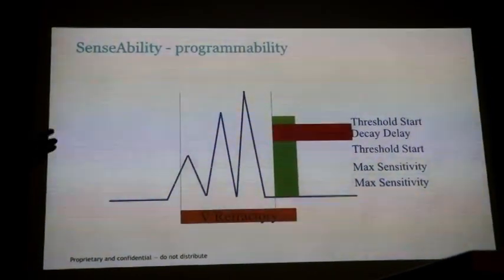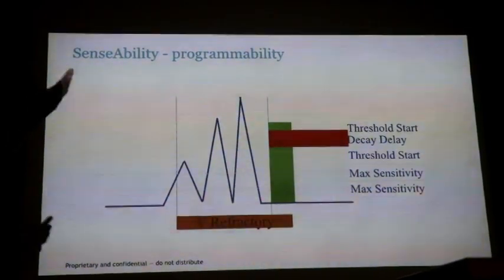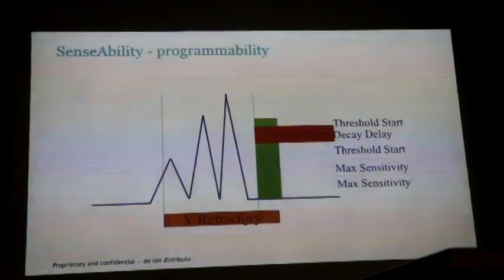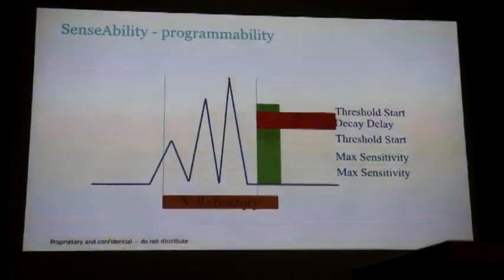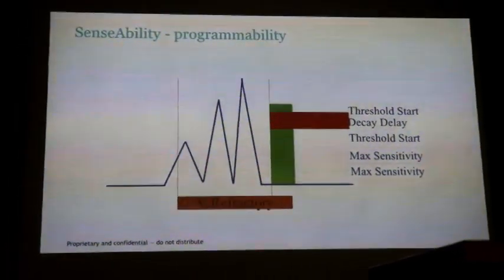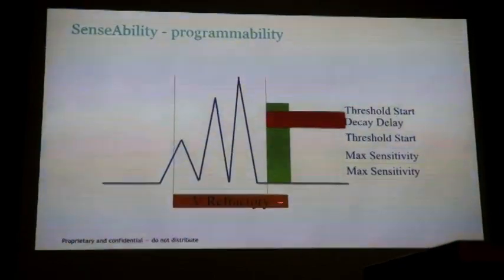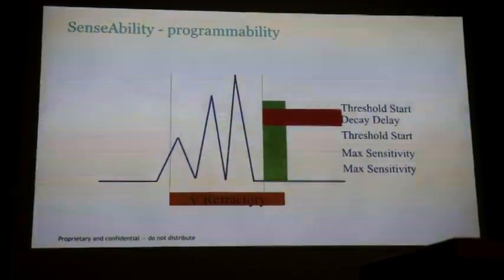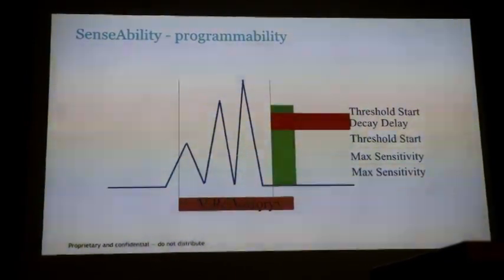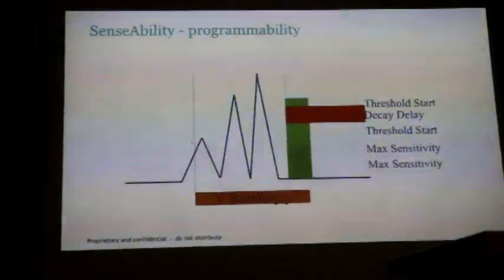So there's all this technology, and it's kind of like, well, which one do I use for which situation? Let's walk through them. The only time you want to extend the ventricular refractory period is if you're double sensing the R wave, sensing the R wave twice. If it's an implant and you're sensing the R wave twice, you should probably move the lead. So you never make these changes at implant. We say, doctor, please move the lead, get a better signal.